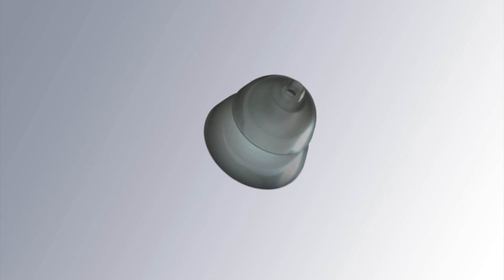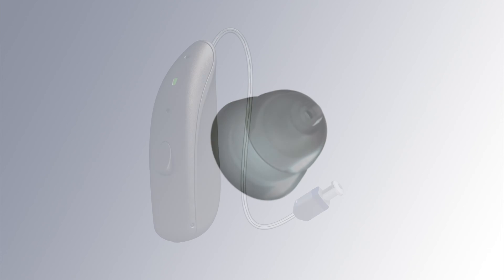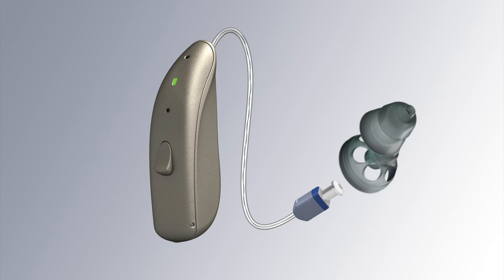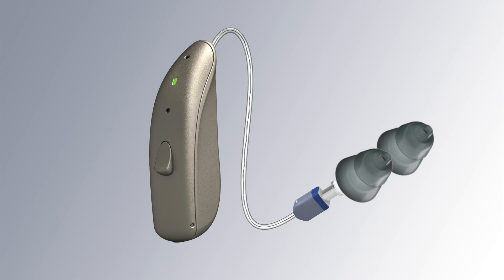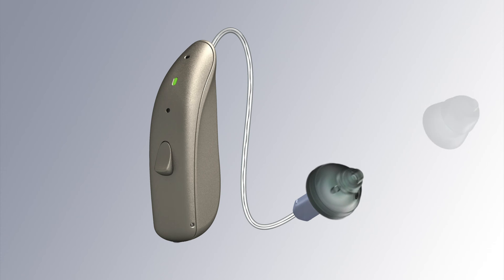Domes come in a variety of different sizes and styles: open fit, vented fit, or closed fit. Rubber domes are also very easy to replace and exchange. If the dome becomes worn out, you can easily replace it, or if your hearing loss changes, a different dome style can easily be tried.